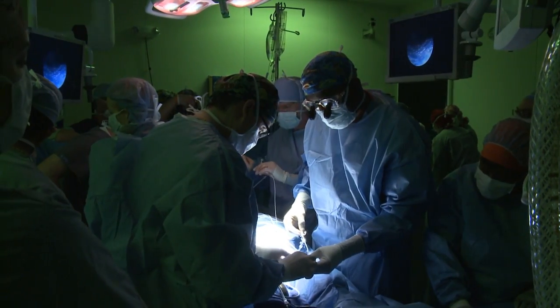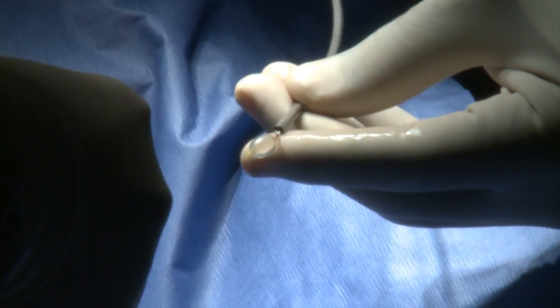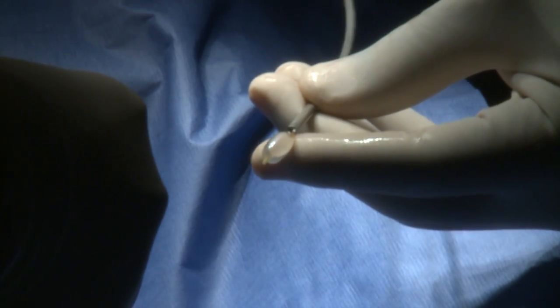So the procedure we did today actually was a case of fetal endoscopic tracheal occlusion, where we put a balloon into the fetus to plug the trachea. Now we're doing that because we've found out from animal work and a lot of work that's been done several years before, that if the lung continues to make fluid all through pregnancy, that fluid comes out from the lungs into the amniotic fluid. Now if you occlude the trachea so that the fluid doesn't come out, you can get the lungs to grow bigger and bigger.